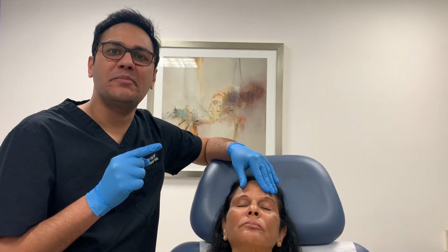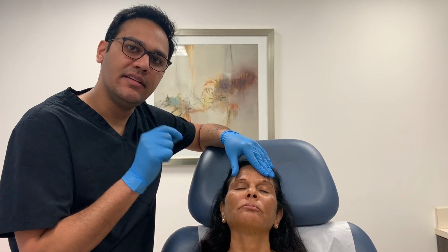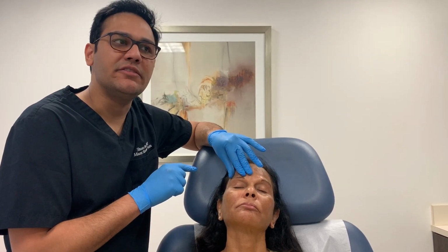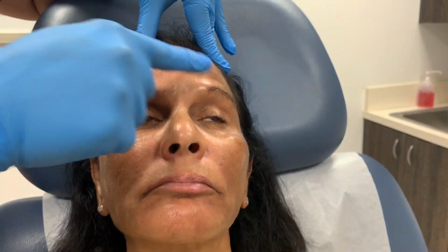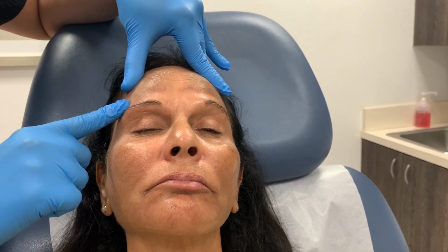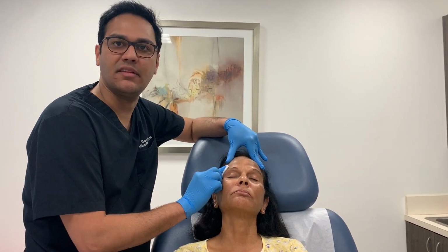So one thing that I always prepare my patients for when using this technique, I used Restylane Defyne pre-mixed or blended with lidocaine and bacteriostatic saline or preserved saline. Because of the lidocaine in there, it is going to be difficult for the patient to raise their brows for the first 45 minutes to an hour, and you can see that in this patient, my mom. Raise your eyebrows. You can see she can raise this brow but not this brow, and that's because of the lidocaine in the filler, and that will resolve on its own over the first 45 minutes to an hour. I mention it here because if you don't know that this is something that happens, you may think something went wrong.